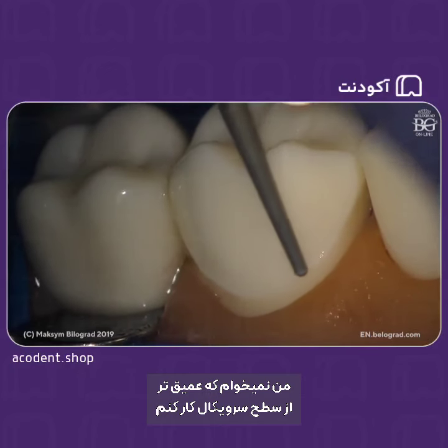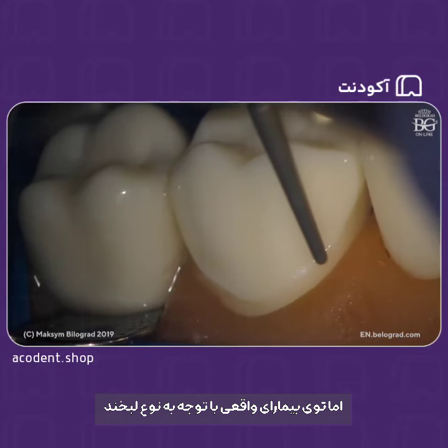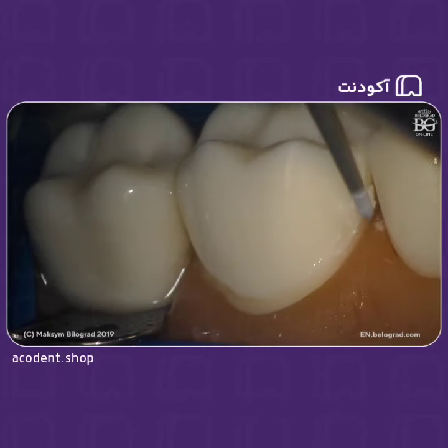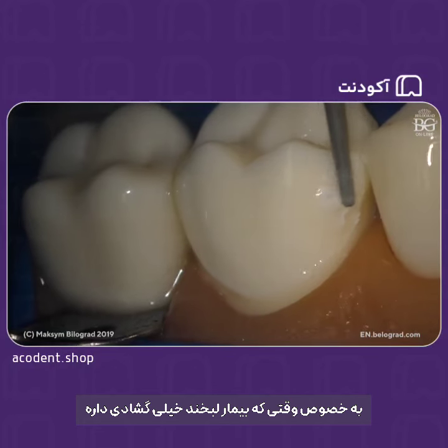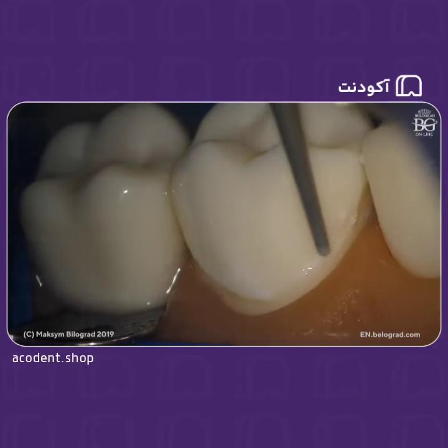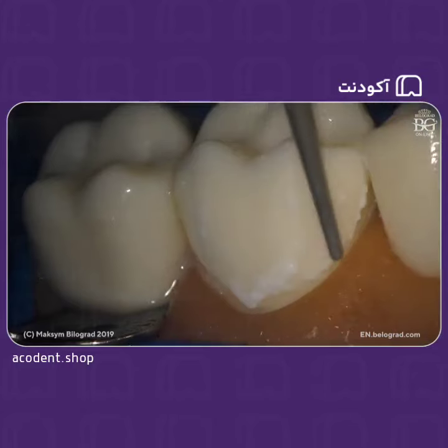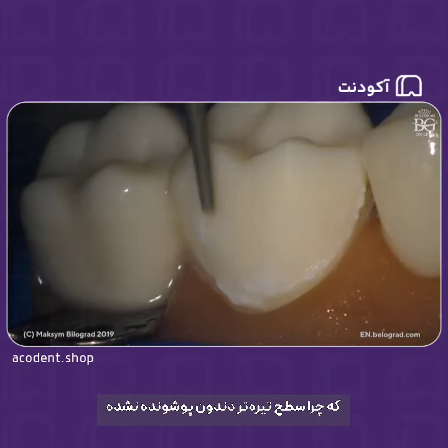I'm not going deeper here on the cervical area, but in the real patient case, depends on the type of smile, I also would go more here just to mask. This is important, by the way, to move more here, because you need to mask that transition, especially if your patient has a pretty wide smile frame. And just imagine this can be visible and your patient will be unhappy with veneers that are not masking the black or dark color of teeth.